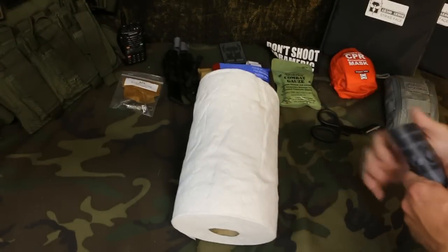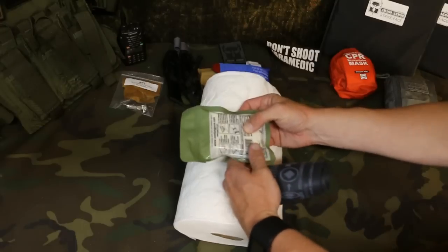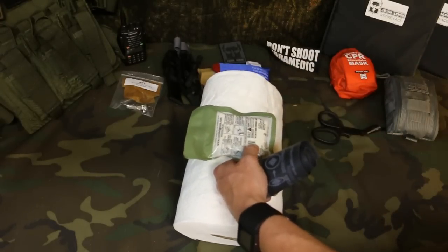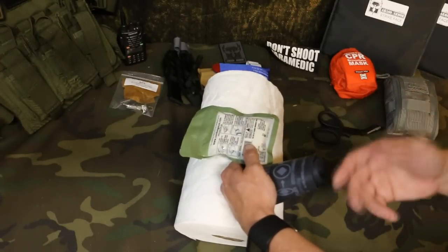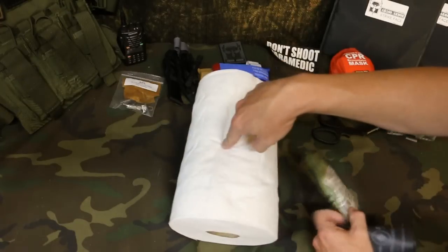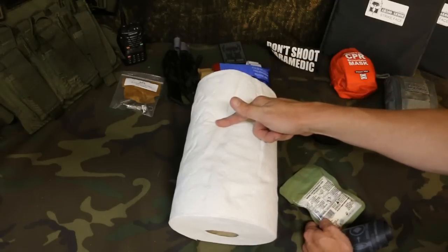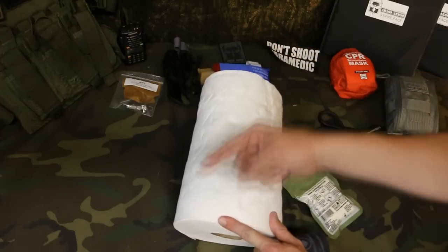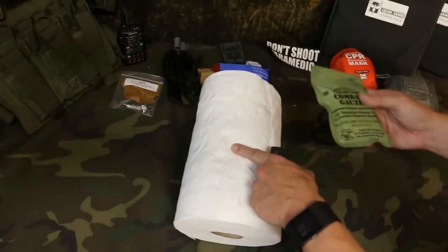The other good thing about the SWAT-T is you can use it as a pressure bandage. Let's say you're going to wound pack — preferably in a joint area like the armpits or the groin, things like that work really well for wound packing. Because if it's in an extremity, just put a tourniquet on and move on. You don't want to wound pack a femoral bleed when you could just put a tourniquet on it. So we're working with a joint area here — wound pack it.